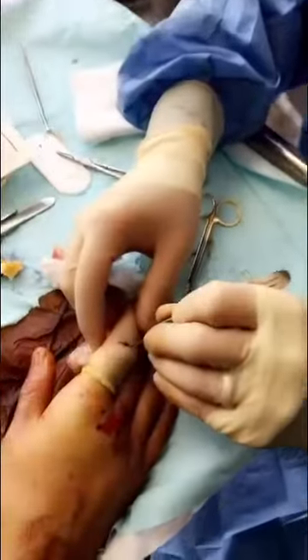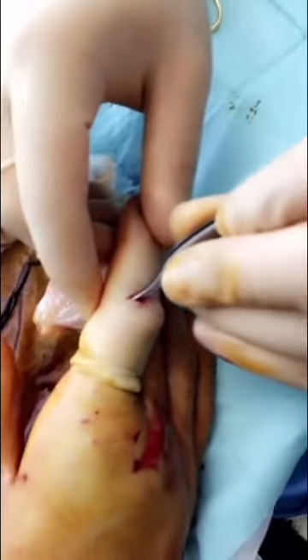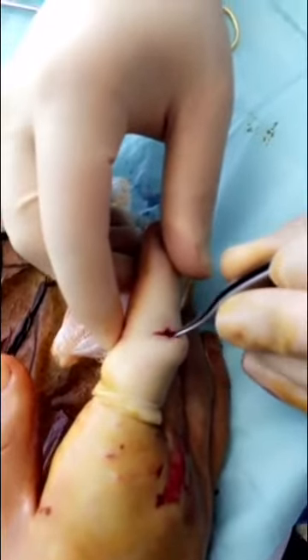I am checking around to see if there are any divots or dents into the deeper structures of the finger. I do not feel any. I looked earlier and similarly didn't see any.